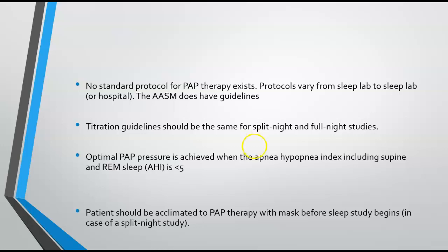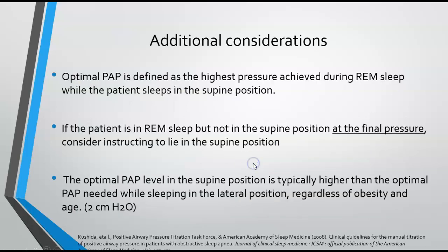The patient should be acclimatized to PAP therapy with a mask before the sleep study begins, especially in the case of a split night study. In the middle of the night, you start CPAP and the pressure is already applied. The patient may get afraid, so you might need to explain to the patient ahead of time.